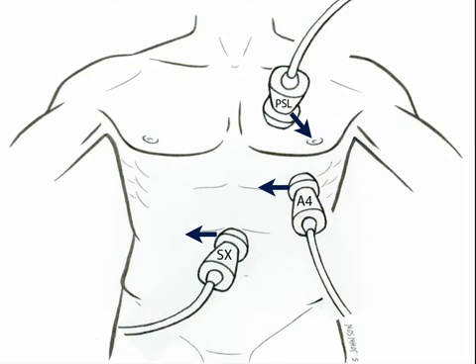Pretty straightforward. We're going to move to the heart now and talk about the three views of the heart you guys learned: parasternal, apical, and subxiphoid. For the parasternal long, we aim the indicator towards the patient's left hip, getting a longitudinal view. For the apical four-chamber, we've got the indicator towards the patient's right, and then we slide down to the subxiphoid view, indicator to the patient's right.